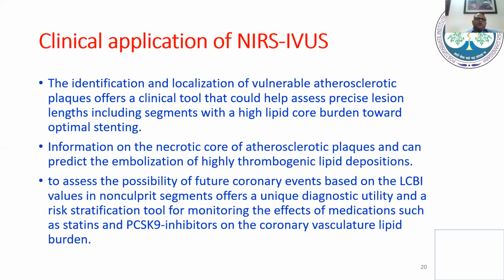This new imaging modality is also going to be helpful to assess the possibility of a future coronary event based on the lipid content index of the non-culprit segment, and offers a unique diagnostic utility and a risk stratification tool for monitoring the effect of statins and also PCSK9 inhibitors in the coronary vasculature.